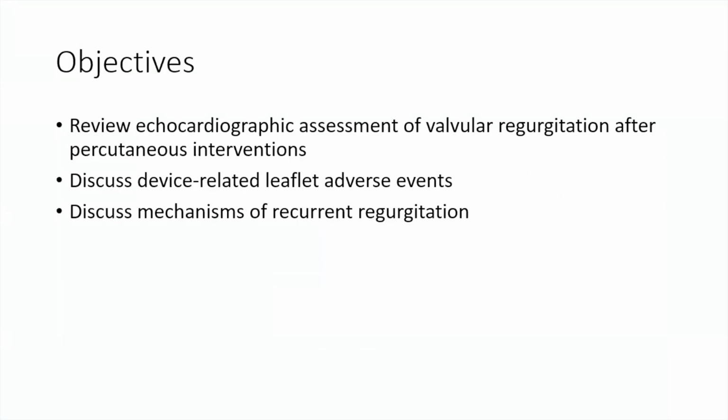But also, I think we will see more and more of these patients, and how to perform these post-procedure echocardiographic assessments was basically my question and my inspiration for trying to learn a little bit more about this. So my objectives are to review the echocardiographic assessment of valvular regurgitation after percutaneous interventions. And more specifically, I wanted to discuss device-related leaflet adverse events and discuss mechanisms of recurrent regurgitation after these interventions.